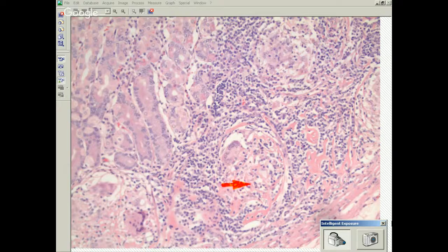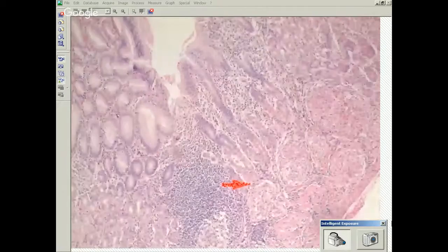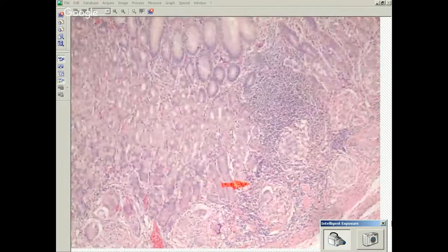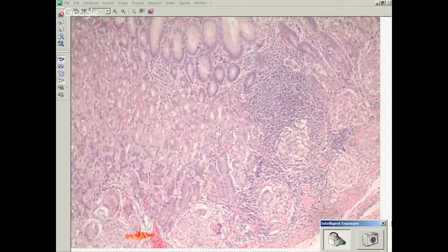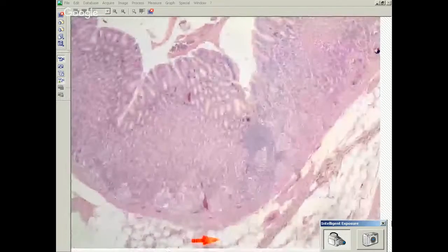Could be hereditary, like chronic granulomatous disease, that's more likely in younger patients. What else? Sarcoid, yeah. So sarcoid, that's actually what this ends up being. And in sarcoid, the granulomas tend to be in the lamina propria or deep, okay? So they're deeper, there's a lot of them, they're non-necrotizing, right? If you see necrotizing granulomas, automatically you should be thinking of TB or some other infectious etiology. But because we're finding them incidentally, you still have to work them out to make sure it's not an infectious etiology. This patient ends up having sarcoidosis, and they actually didn't even know about it.